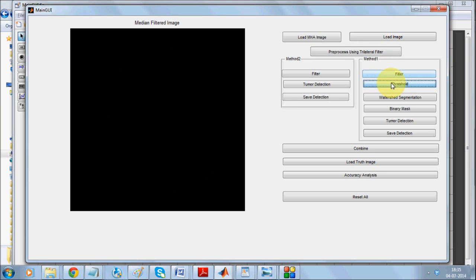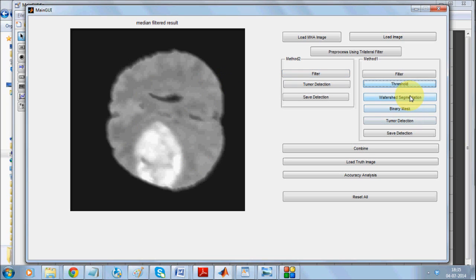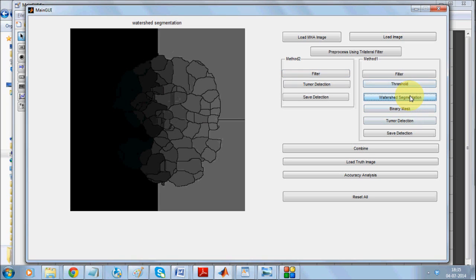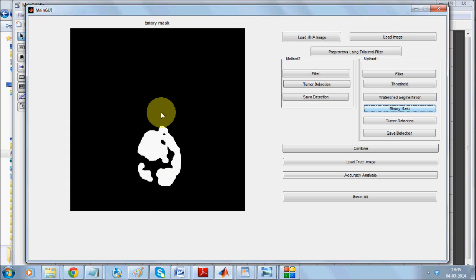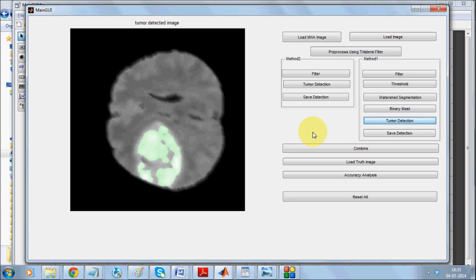I'll apply a median filter and threshold so that the median filter produces some result like this. I'm going for watershed segmentation and post watershed segmentation, going for a binary mask. Now as you can see this has detected a much bigger area than the previous method. We'll go for tumor detection and save it.